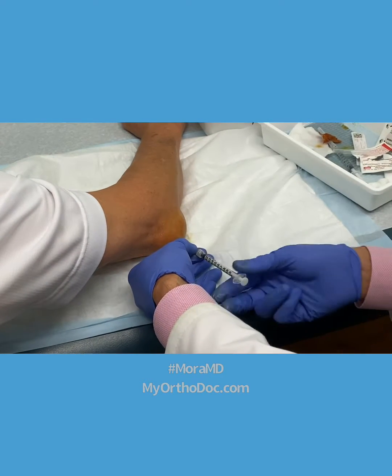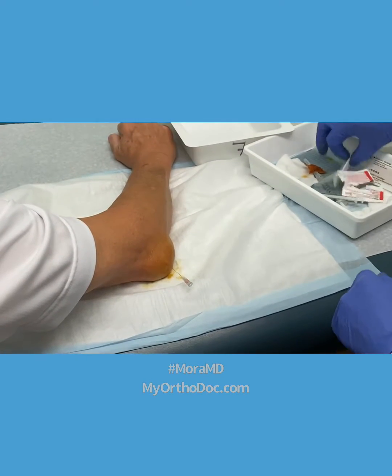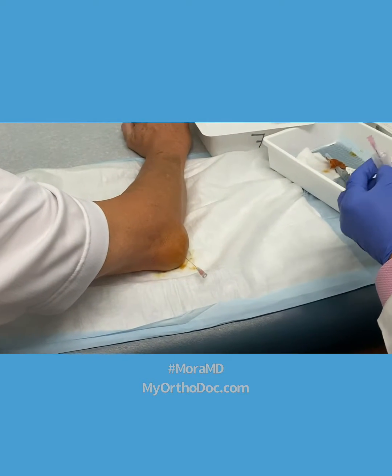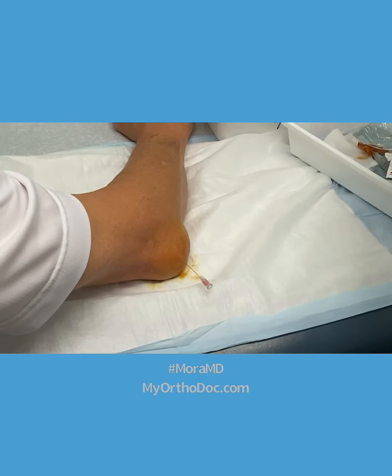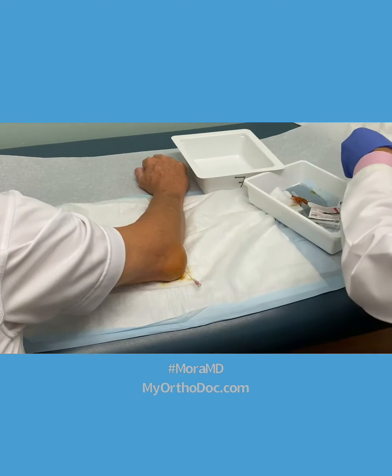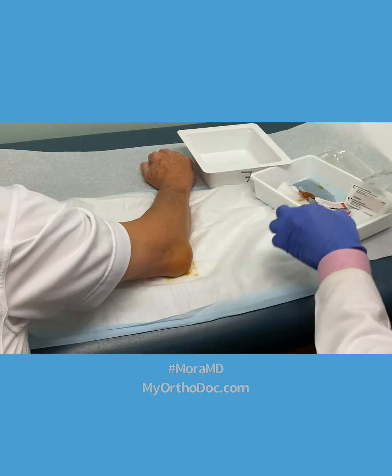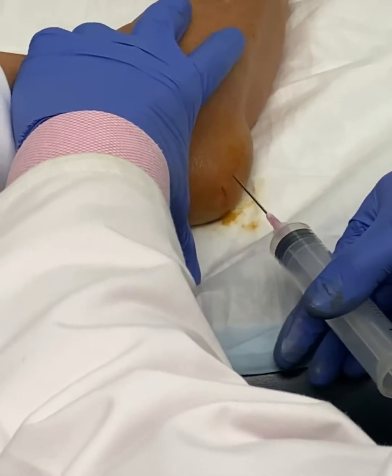I leave my needle in there just for a second, just to give me the trajectory. I'm switching over to an 18 gauge because I saw blood in there already — I know it's going to be thick. One thing everyone watching needs to know: if you see this on one of your patients, get an x-ray first.